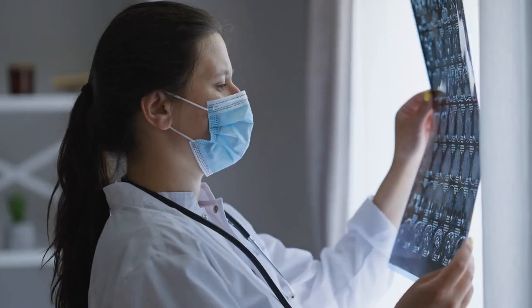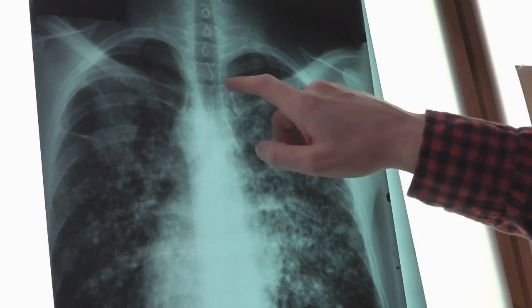So having said that, I've given you these different parts of the peripheral nervous system. We then design a test around what we think is going on. Now, there are some times where a doctor might refer a patient to me and it just says weakness. That's not the most ideal way to approach nerve conduction testing with the patient, because it's kind of like an x-ray machine. Let's say you have a broken leg. If you are sent to the radiology department and they have no idea why you're there, they just have x-ray machines, and they do a chest x-ray, but you have a broken leg, it's not going to tell your doctor anything about your broken leg, right?